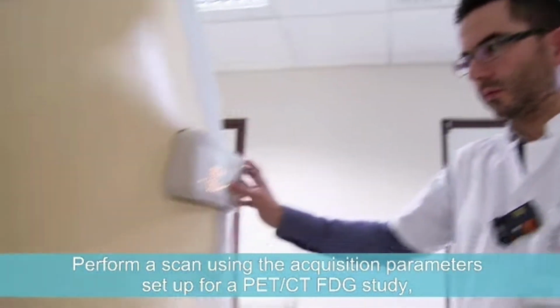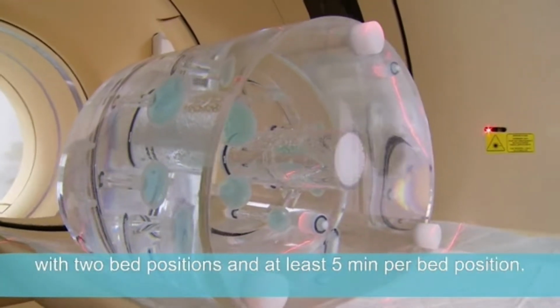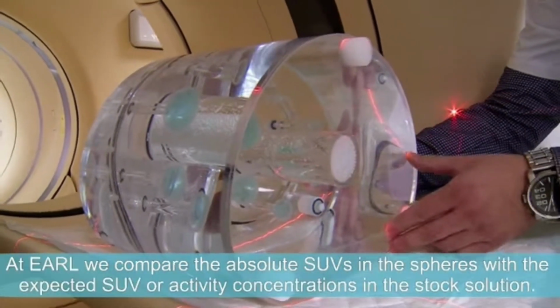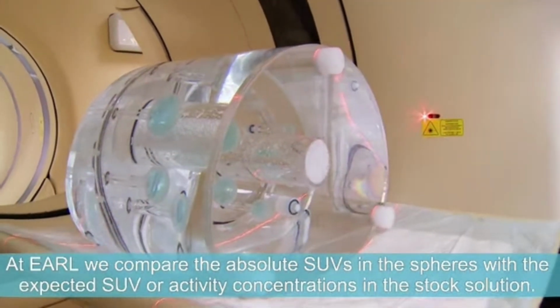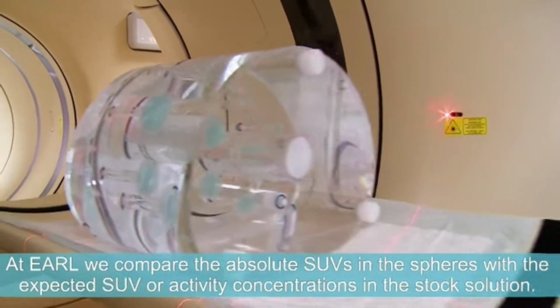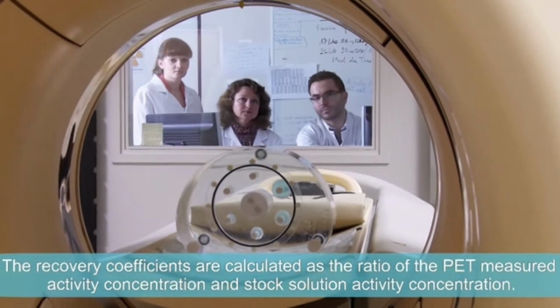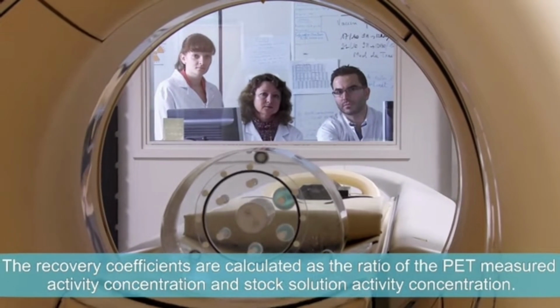Perform a scan using the acquisition parameters set up for a PET-CT FDG study, with 2 bed positions and at least 5 minutes per bed position. At EARL, we compare the absolute SUVs in the spheres with the expected SUV or activity concentrations in the stock solution. The recovery coefficients are calculated as the ratio of the PET measured activity concentration and stock solution activity concentration.